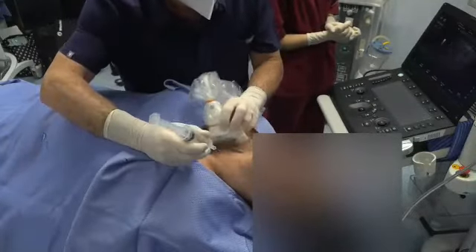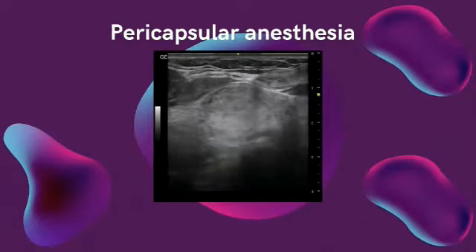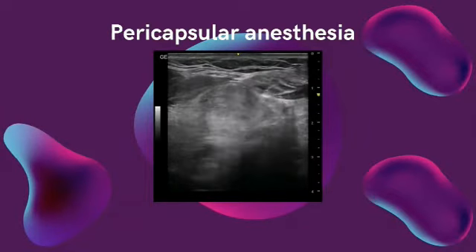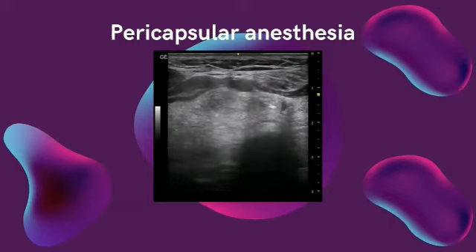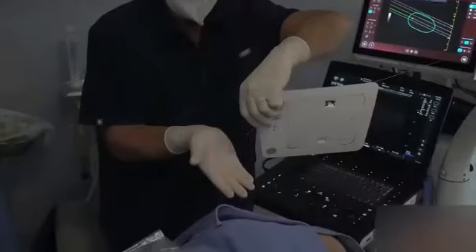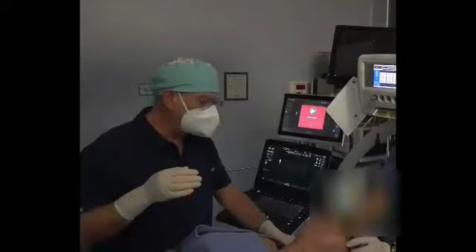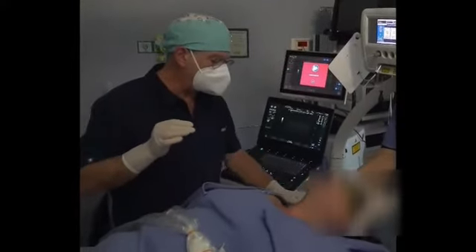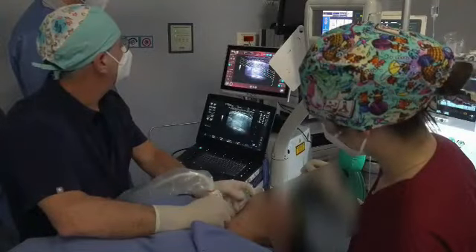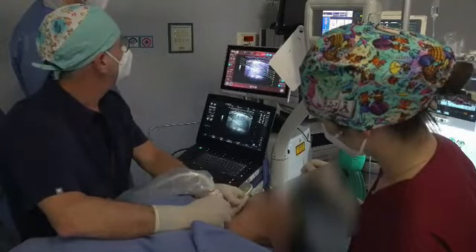Once planning is complete, a pericapsular and a subcutaneous anaesthesia is performed. The local anaesthesia was performed with 2% lidocaine. The optical fibre is connected to the generator. The power range is from 2.5 to 4 watts, depending on the nodule's volume and position. In our case, we are using 4 watts of power.